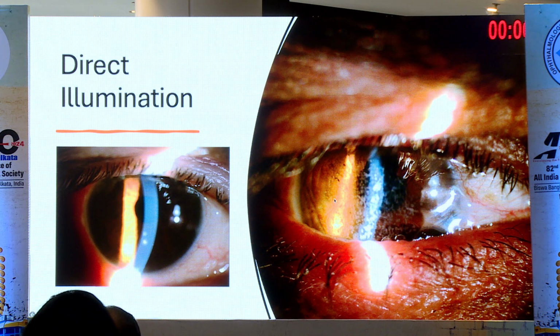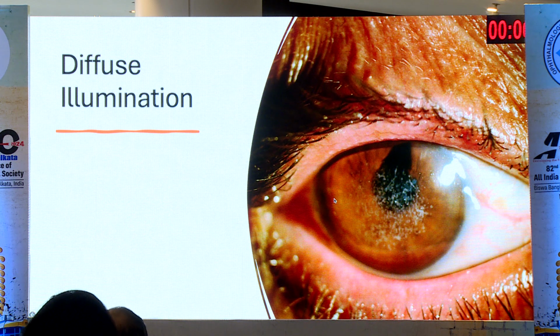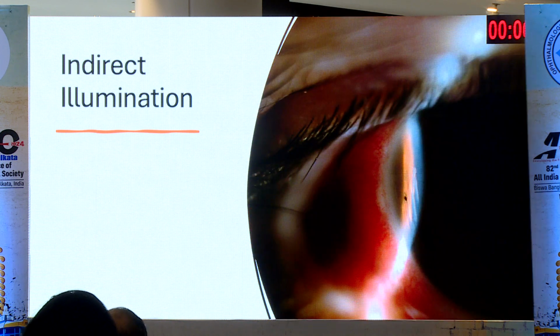Diffuse illumination will be where you don't have a slit beam and the diffused light illuminates the whole of the eye. And then indirect illumination, wherein the light falls onto the iris and the reflected light from the iris will define the object you want to focus on.